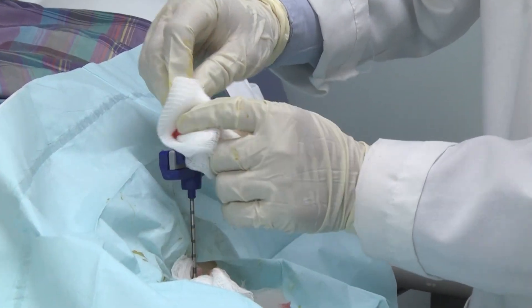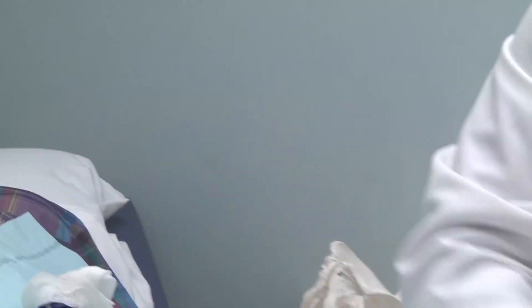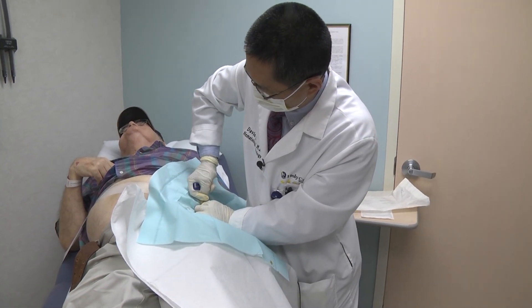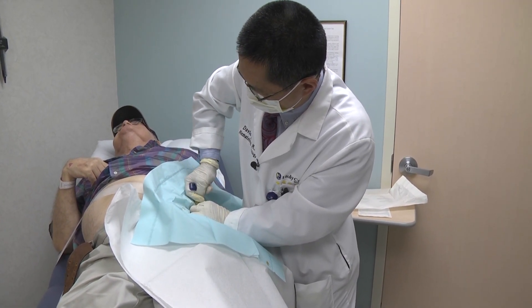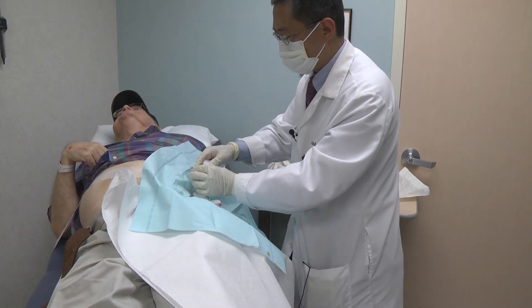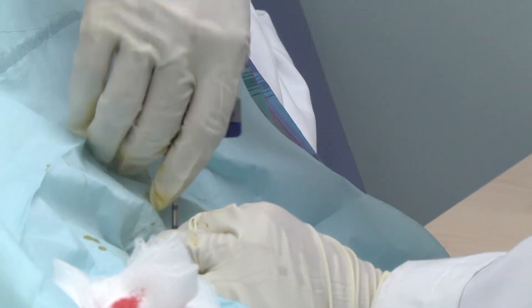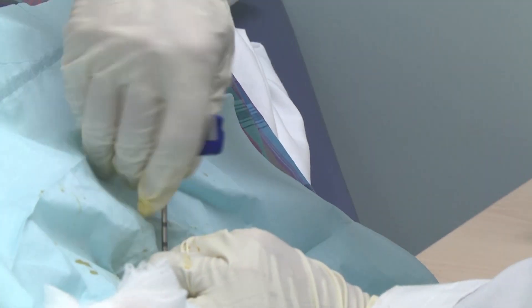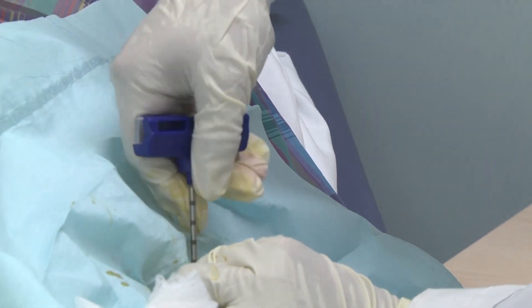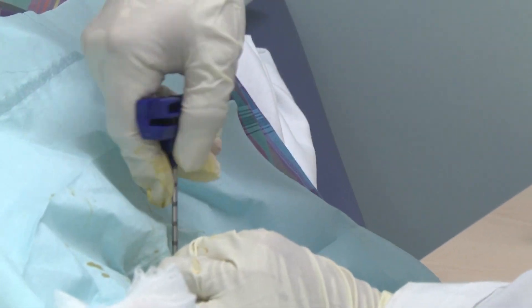I use a gauge to guide the depth. Last push. Lock it. Turn. There. Gradually coming out. Now you can talk — hurting? No, it's all right.